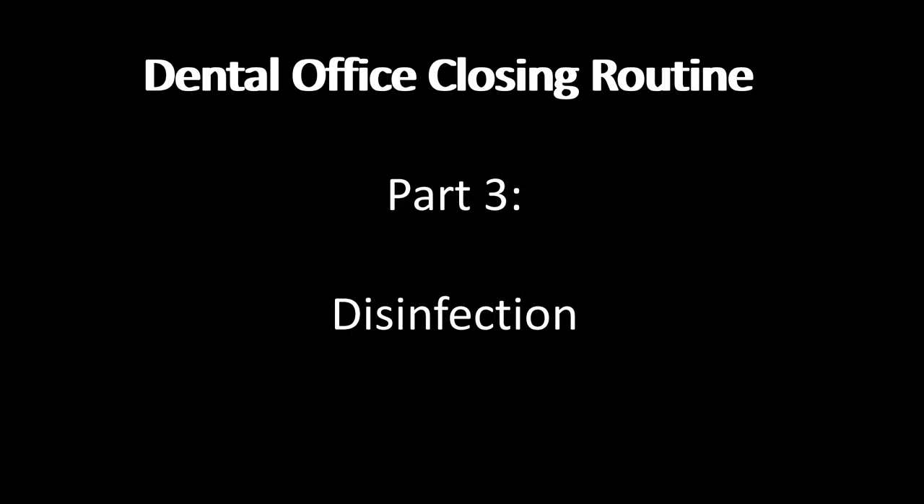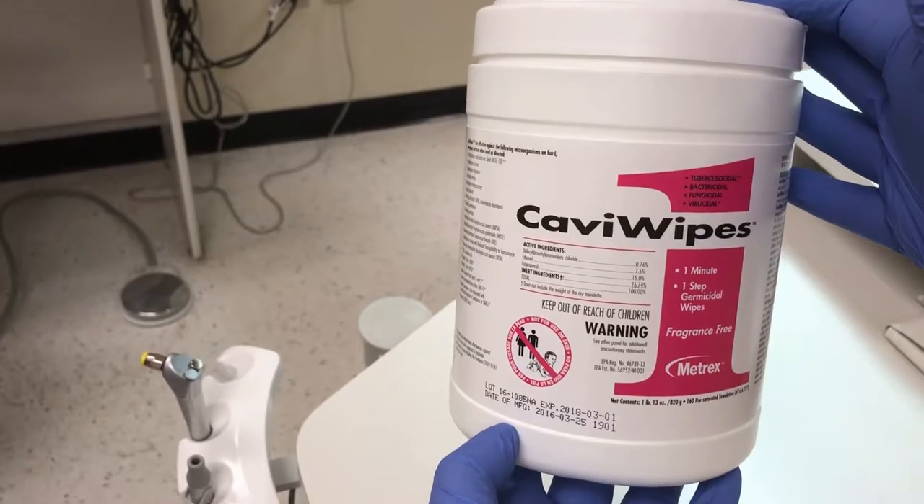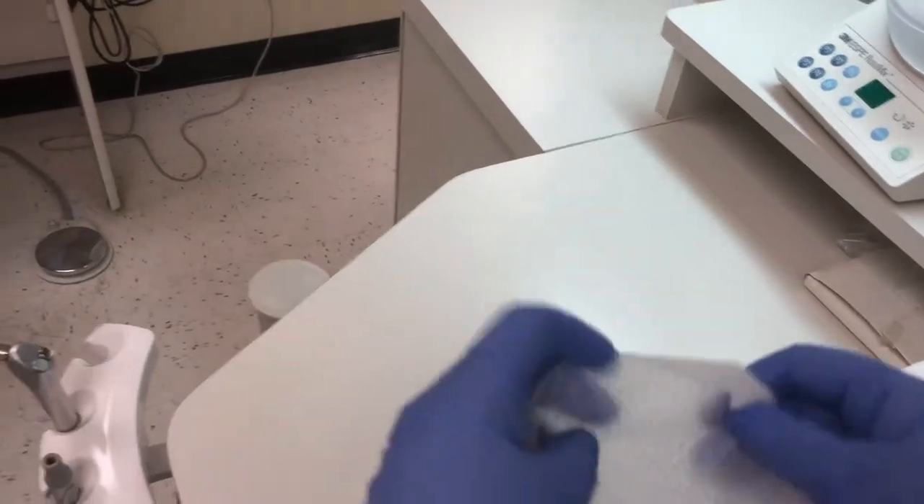After completing the first two parts of the dental office closing routine, we are ready to do the third step, which is disinfection. First, change into a new pair of gloves. Second, select your disinfectant of choice. Here I have a pre-moistened cabiwipe.